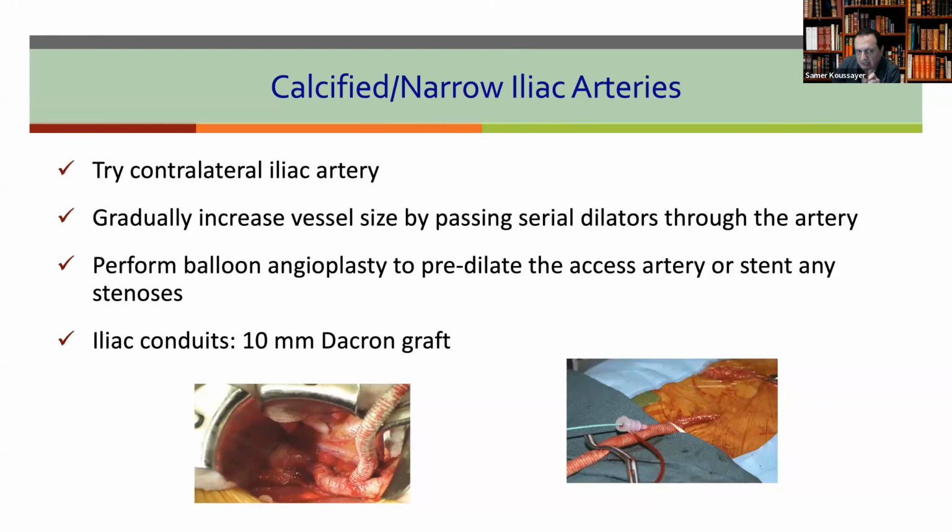But don't try to put a dissection stent before you put an EVAR, because it's a fresh stent, mostly in a tight area, so it may get captured with the EVAR device. Okay, if you have a rupture, that is a different story.